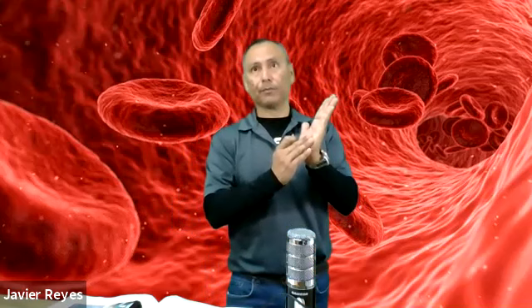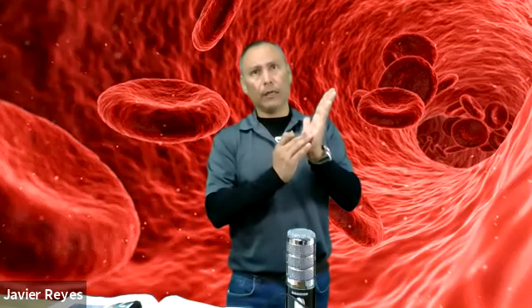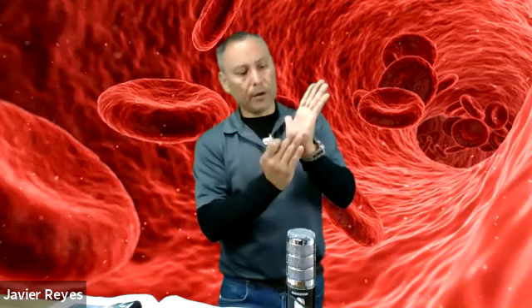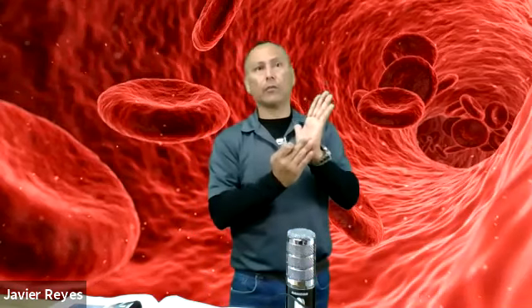The vascular beds are right below the skin. The epidermis is what we're looking at, and then you have your dermis, which is right below. This is where you have all your capillary beds. This is where all the rich blood is.